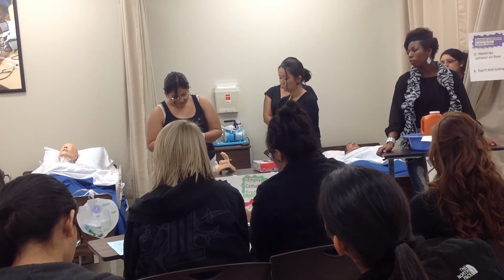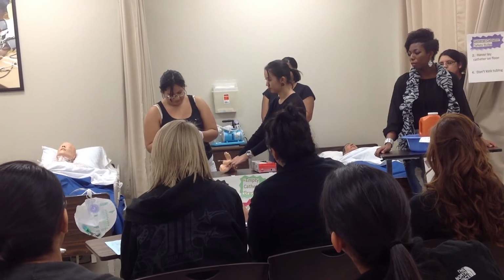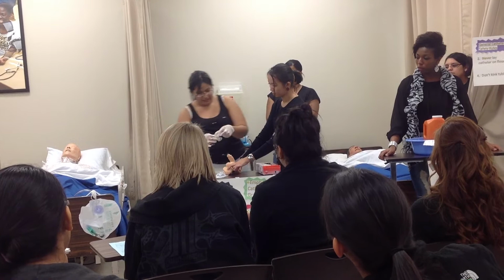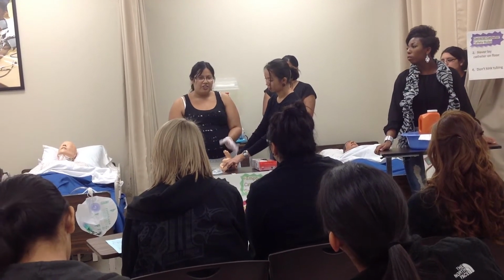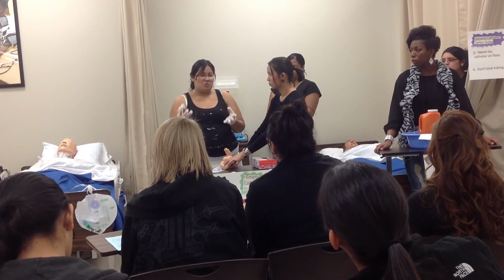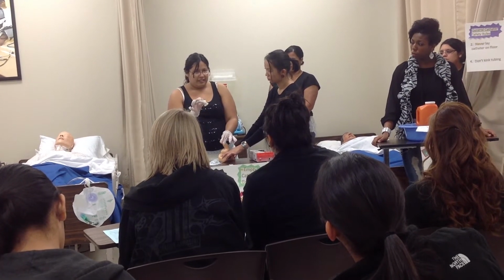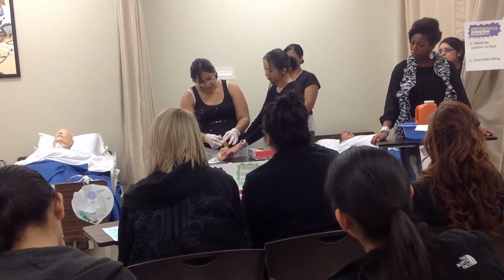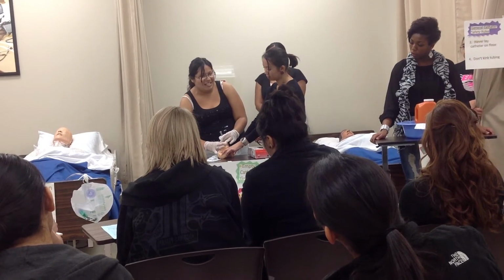Okay, so you're going to go ahead and get your condom catheter. It's really, really sticky. Okay, so you're going to apply it. If the patient is uncircumcised, you're not going to want to pull that skin back when you're applying it because it's just going to make it swell up. So you're going to want to make sure that the skin is frontwards when you're applying this. Put that on there, leaving about 1 to 2 inches to breathe.